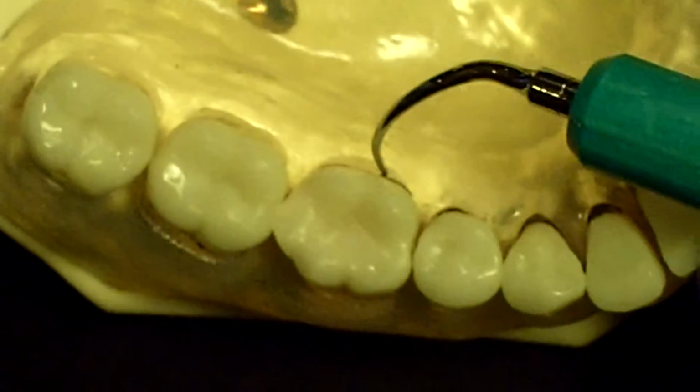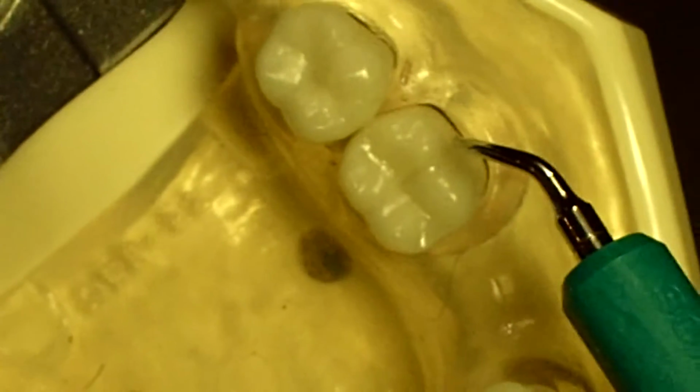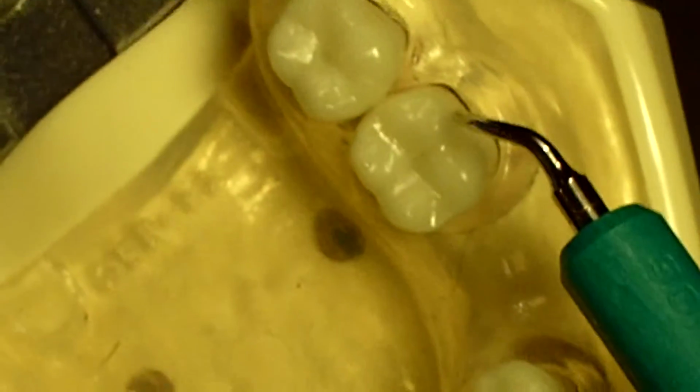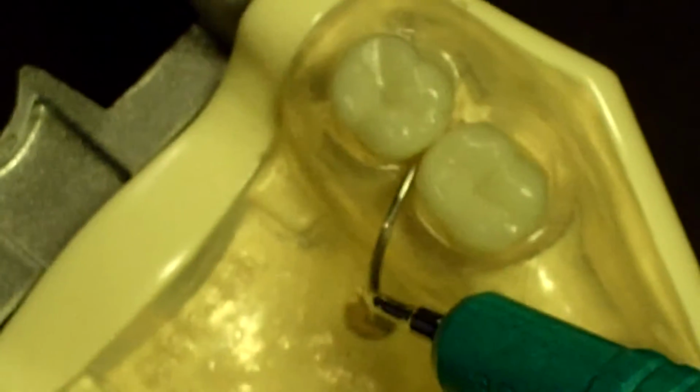So if vertical is correct here, we know that vertical here is going to be correct. If we know that vertical here is correct, we know that we can also use it transversely on the opposite side of the tooth.